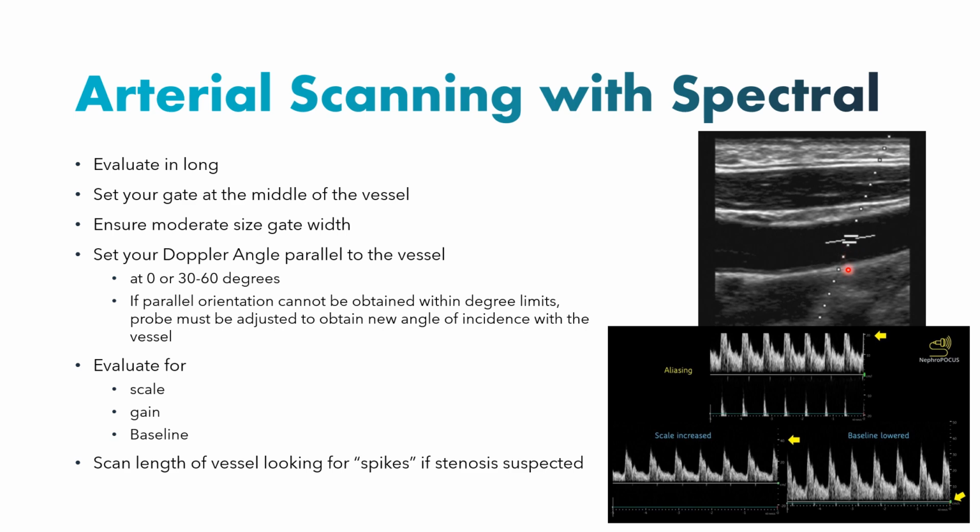What we really want is typically something pretty moderate to pick up the flow right in the center of the vessel, not so large that it's going to be picking up that peripheral flow, not so small that it's not getting a large enough sample.